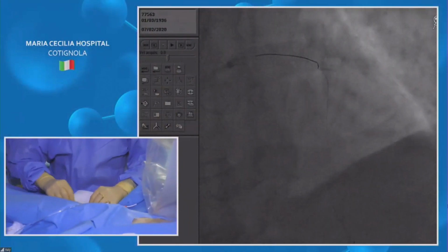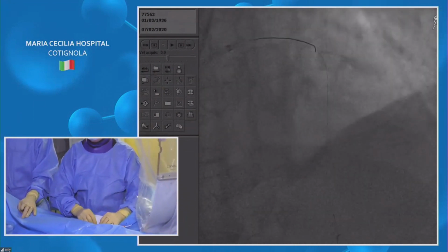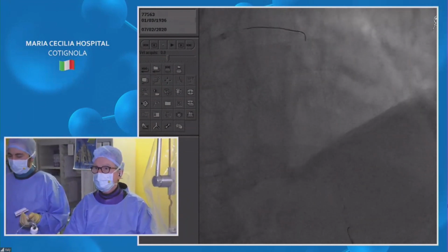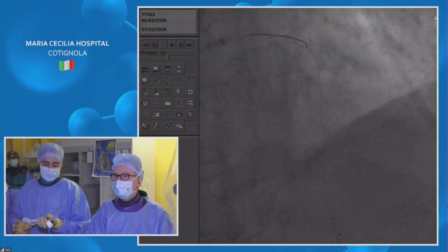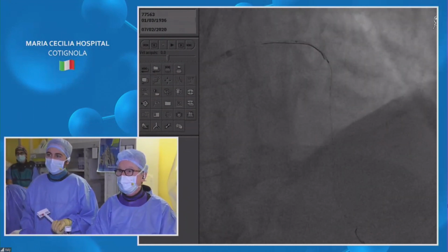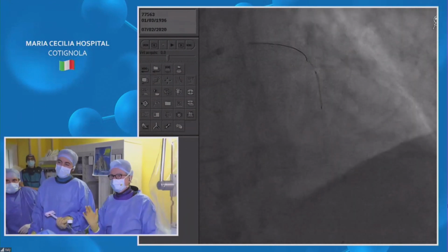Okay, so this is a 60 micron stent. All sizes are 60 micron. The other small thin strut stent is thicker when you go to 3.5. So the length is really very appropriate.